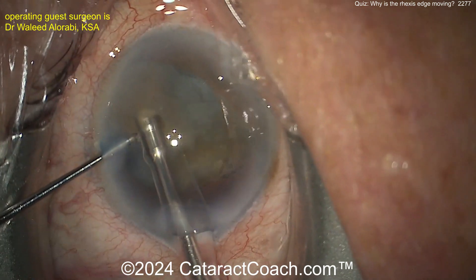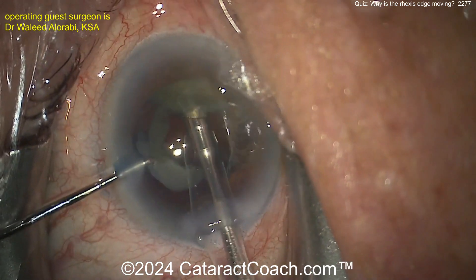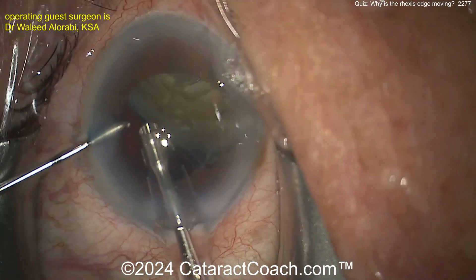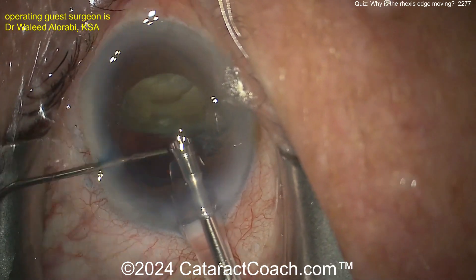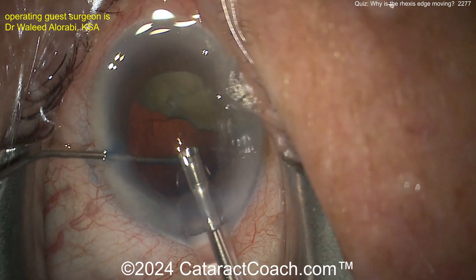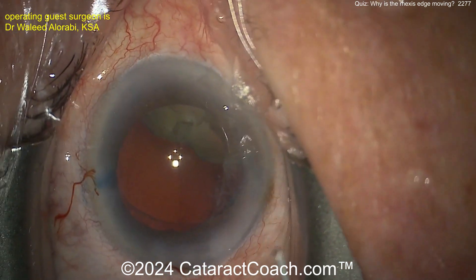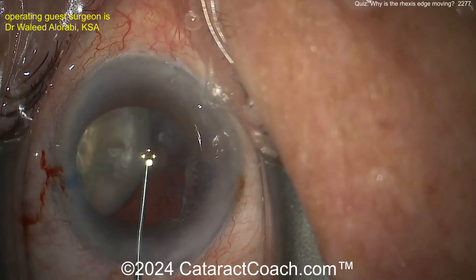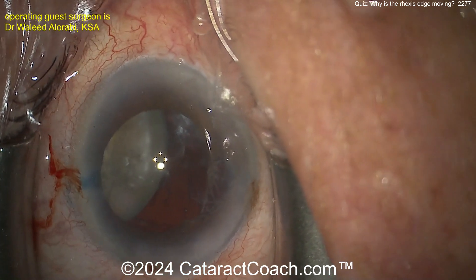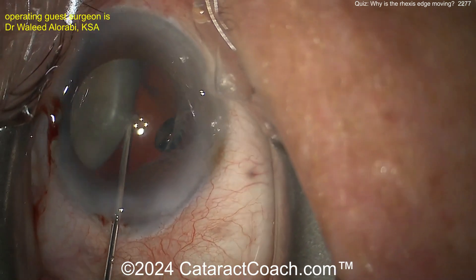As you remove these pieces, you're not supporting the bag. When the nucleus is in the bag, even if there's a quadrant of zonular loss, you're supporting it with the nucleus. As you start to remove the pieces, that area of lack of zonular support is going to start to collapse. Here's what's remaining of the nucleus — about half is left. Get some more viscoelastic in.